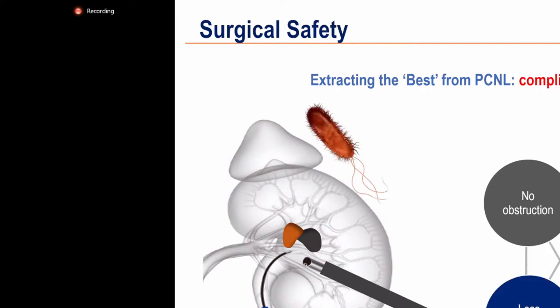How about the surgical safety? We can first choose less complications. And sometimes we have to stop stone fragmentation if there's much bleeding through the percutaneous tract. And we have to remove the percutaneous tract and can leave some remnant stones. Then it may mean we can negotiate the best results considering patient safety.